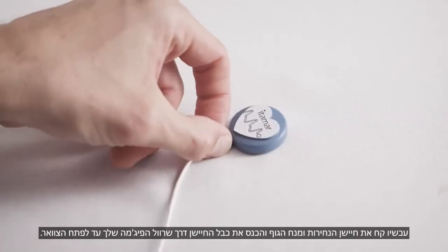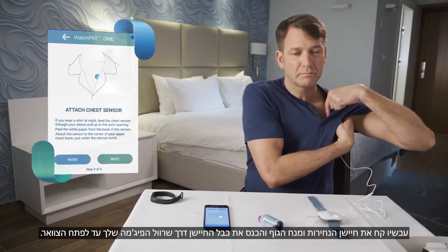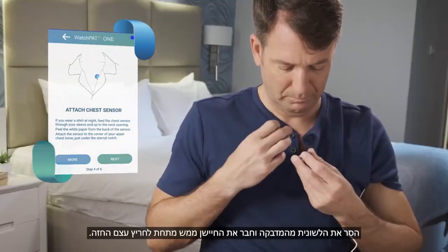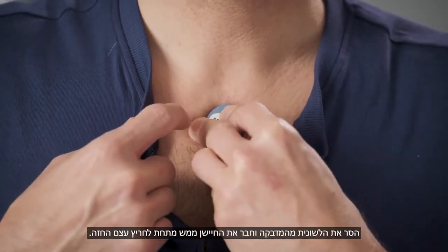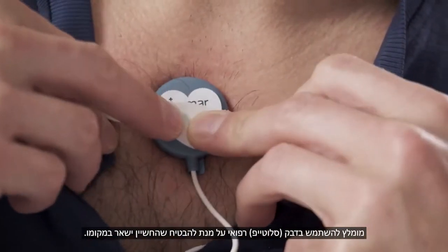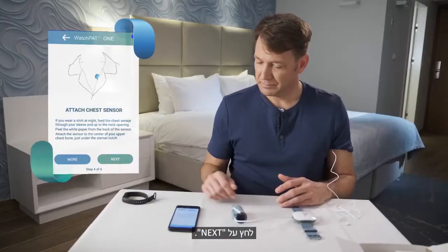Now take the snoring and body position sensor and direct the sensor cable through your pajama sleeve up to your neck opening. Remove the tab from the sticker and attach the sensor just below your sternal notch. It is recommended to use medical tape to secure the sensor in place. Press Next.